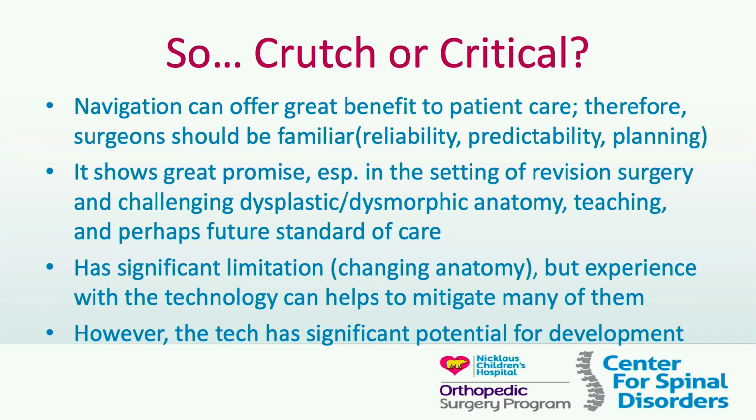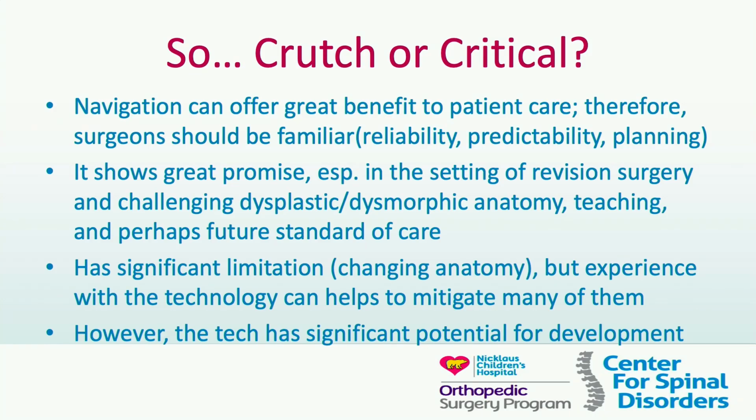In my hands, I really think it shows great promise, especially in revision surgery, challenging dysplastic or dysmorphic anatomy, teaching, and perhaps in future standard of care. I think this is becoming more and more accepted, and I don't think that the unpredictability and unreliability of some freehand techniques is going to be acceptable as we move forward.